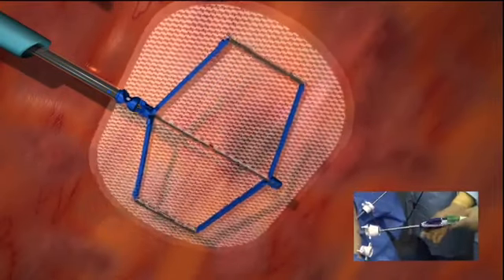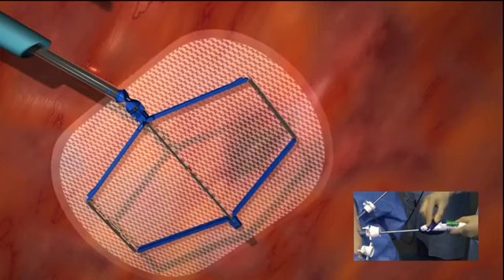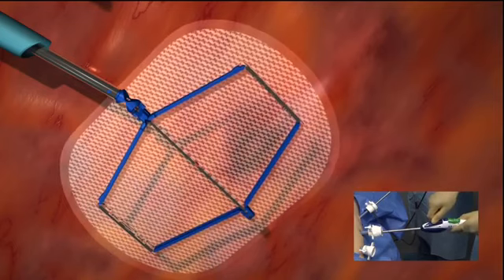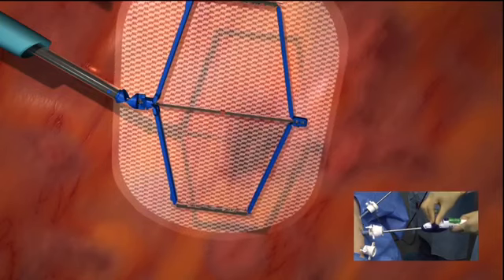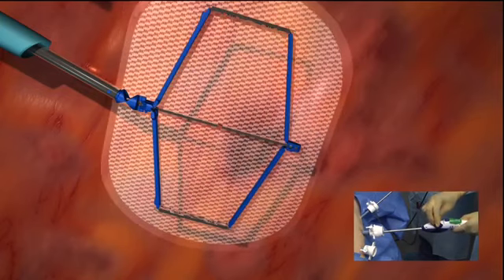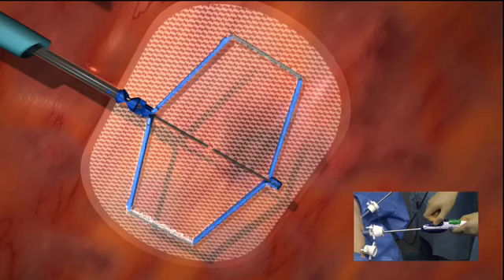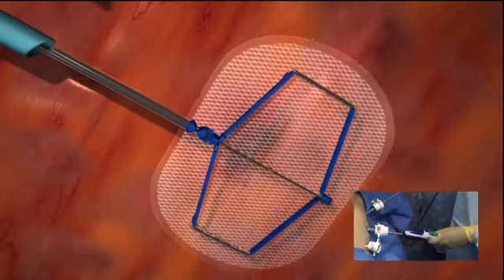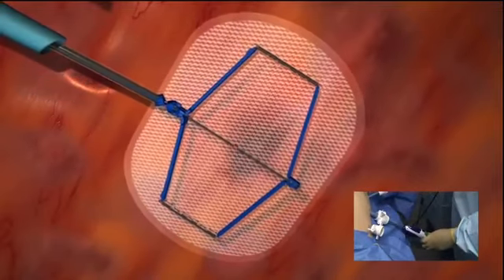If necessary, rotate the mesh utilizing the articulation knob until it is correctly oriented with respect to the hernia defect. The maximum articulation of 100 degrees is reached when the articulation knob is at 90 degrees to the shaft. Use the frame and accuracy dot to accurately center the mesh relative to the defect with consistent overlap on all sides. Simply raise the AccuMesh device and allow passive articulation to adjust the mesh against the abdominal wall.